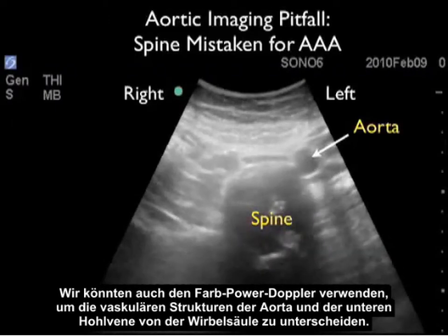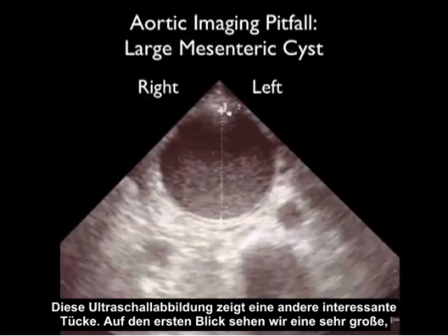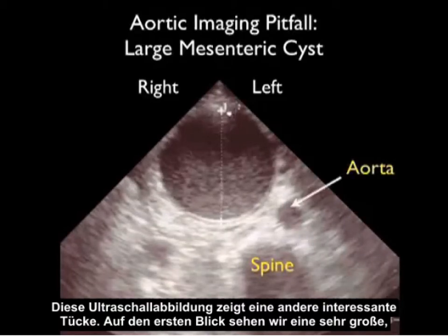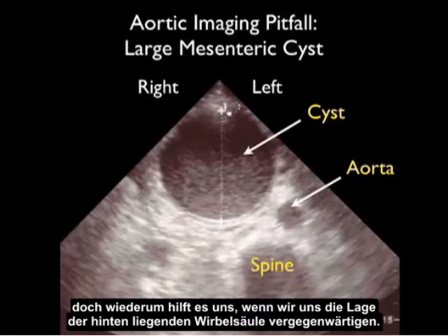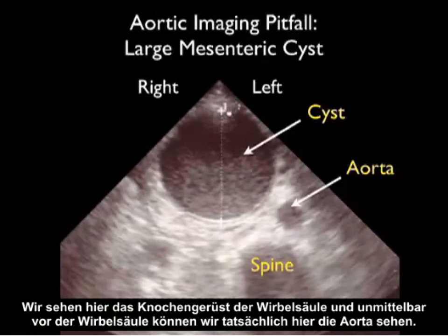This ultrasound image shows another interesting pitfall. At first glance, we see a very large dark structure towards the top of the picture that could be mistaken as a very large abdominal aortic aneurysm. But close attention to the location of the spine posteriorly will help us out — notice the bone table of the spine, and just anterior to the spine we can actually see the aorta. This very large structure is actually a very large mesenteric cyst, and it failed to have pulsations with power color Doppler.